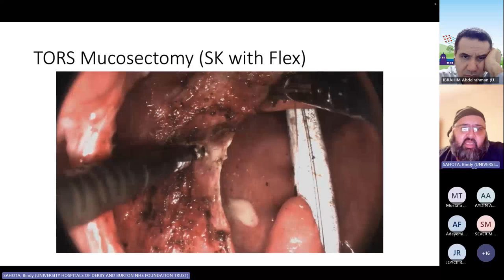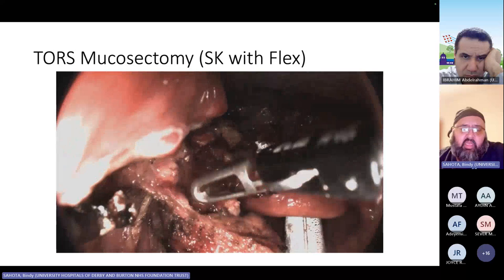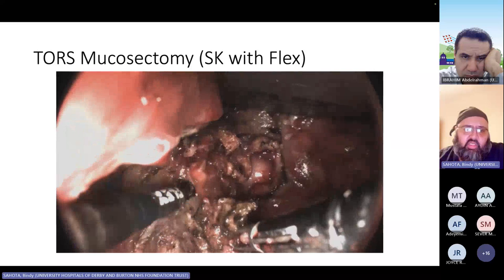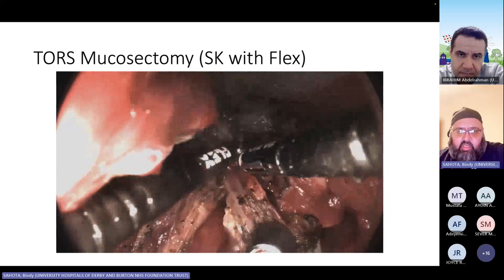And here's the tonsil coming out in unity as a single block unit there as a whole. And then you can see the styloglossus underneath you, which is just sticking there. And see that all coming off in like a single unit as a whole. And there it's being dissected and moved around.